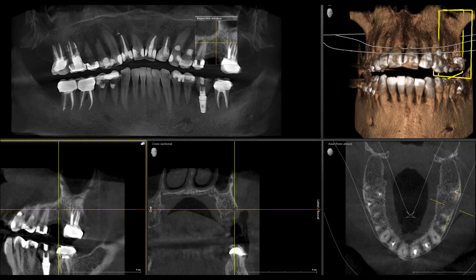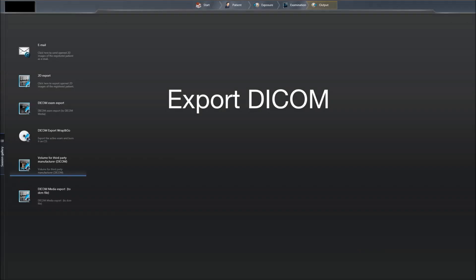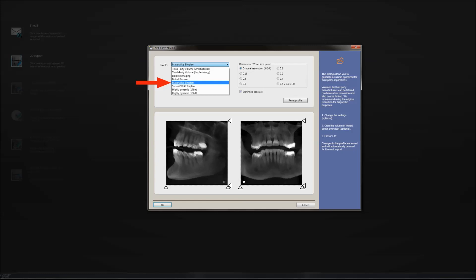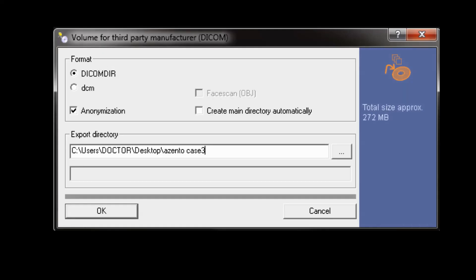Once you have a CBCT scan, we have to package that data in a way that we can upload it to the Azento portal. If you have Cydexis 4.2 or higher, you're going to be able to click on Output and then you're going to see a volume for third-party manufacture. If you have an earlier version of Cydexis, you can click on the DICOM exam export — we're just trying to package up a DICOM file. Your workflow you'll choose will be a Simplant workflow, and if you have that option for third-party manufacture, then you would choose Simplant. Then you're just going to choose the directory where your DICOM file is going to be saved.